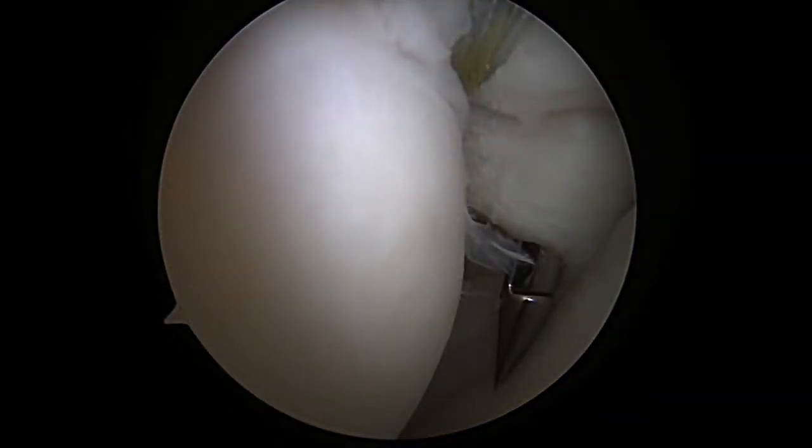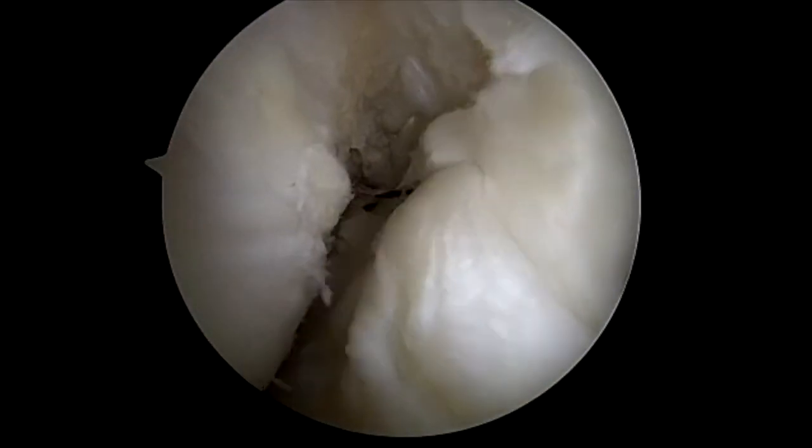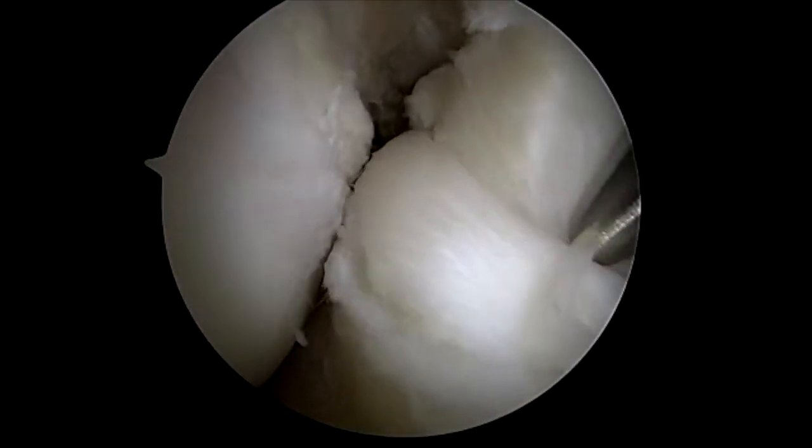After implanting the swivel lock, I then put a bird beak through the subscapularis and retrieve the sutures from the anchor. I then use a probe and pull on the sutures to trial reduction of the rotator cuff.